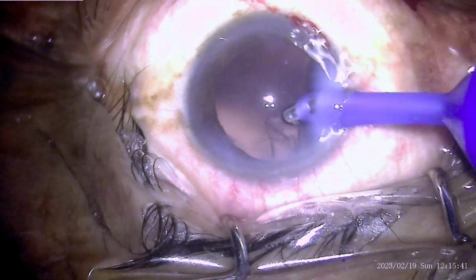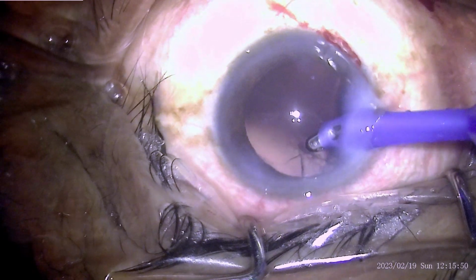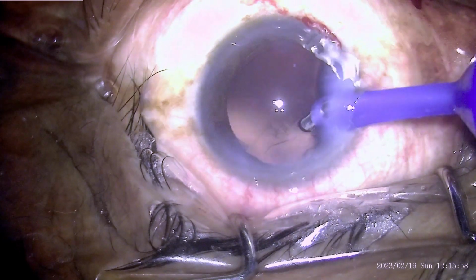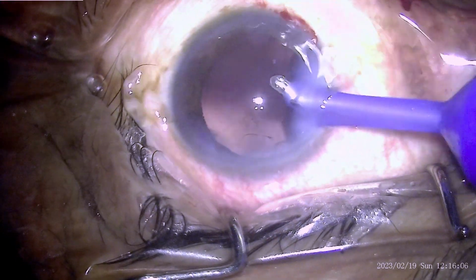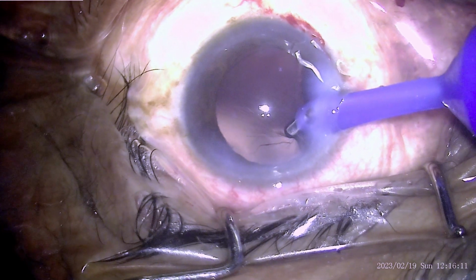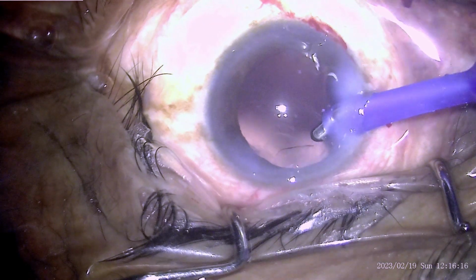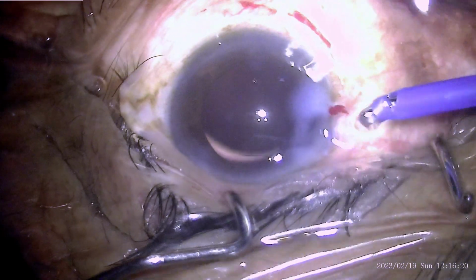And we will fast forward to the point where there is a subincisional cortex which is to be aspirated. Now watch, what happens is the surgeon is trying to aspirate it, and in this event the probe is being withdrawn out, and this causes the irrigation ports to be choked because they are in the incision, and at the same time aspiration is going on, so posterior capsule comes up and is aspirated and caught, and then there's a PC rent.